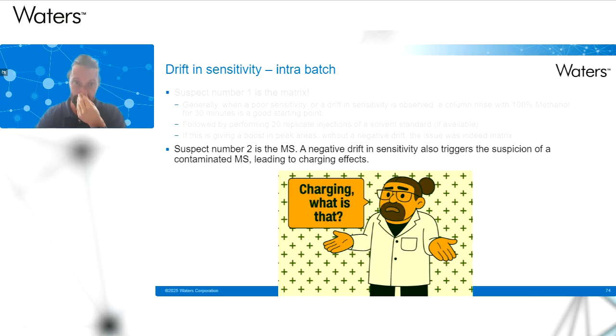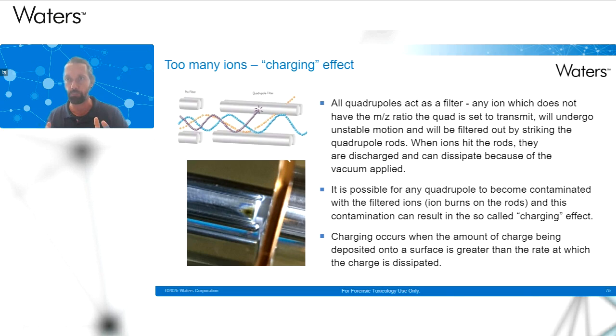Charging, yeah, what is that? Well, typically charging is a phenomenon that is observed after your MS has been contaminated. In this case, we can see what we call an ion burn on one of the quadrupoles, and that ion burn will pretty much act as a magnet for all the ions passing by. And this will typically present itself as a decrease in sensitivity during one series.